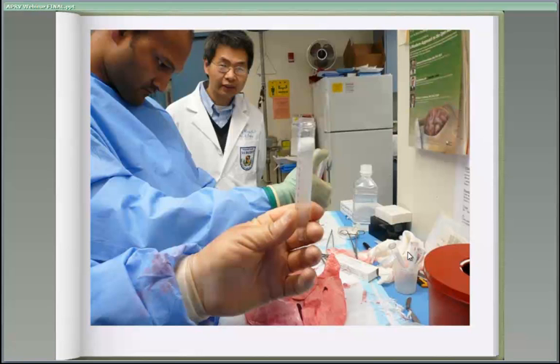Now, what we do see in some of the other animals on cross-section is that the surfactant seems to be already in the airway and oozing out of the distal air spaces. In the APRV lungs, we don't see that, and we actually have to fetch the surfactant out by lavage. So this is the lavage of the surfactant in the APRV lung post 48-hour sepsis and necropsy.